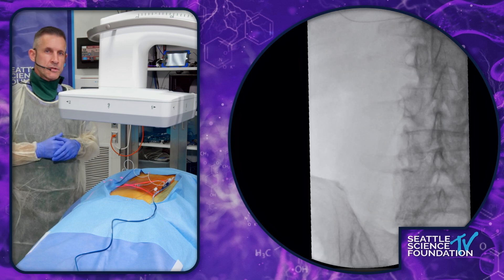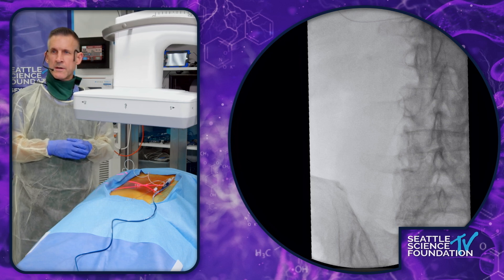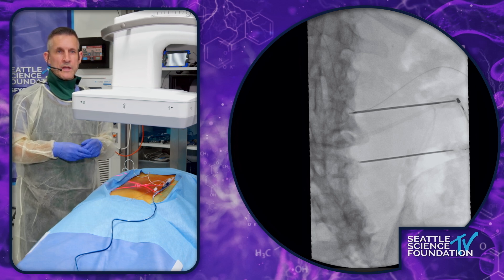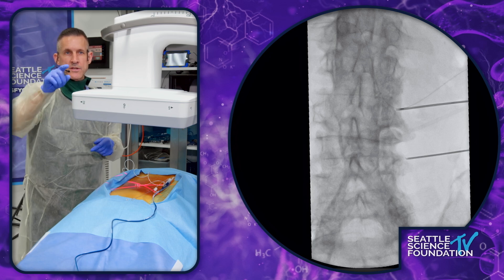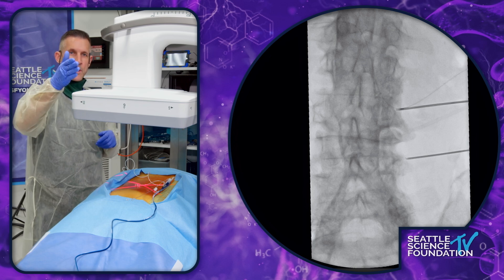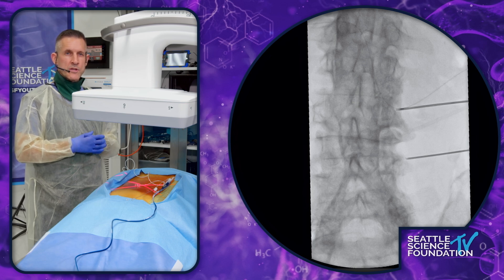On the AP image, ideally we want to be pretty close to where we are. You can see the tines are coming out, and we want to be maybe a touch closer to where the superior articular process and the transverse process come in contact with each other. But this looks pretty good.